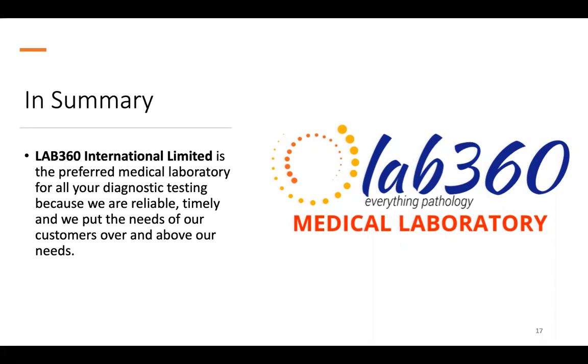So every sample is barcoded just to ensure that every patient is recognizable, even when their samples leave the phlebotomy room into the laboratory. I did hint on patient identification. First and foremost, we ensure the patient is identified by asking them to repeat their surname and first name, and sometimes their date of birth, just to be sure you're working with the right patient right from the sample collection phase.